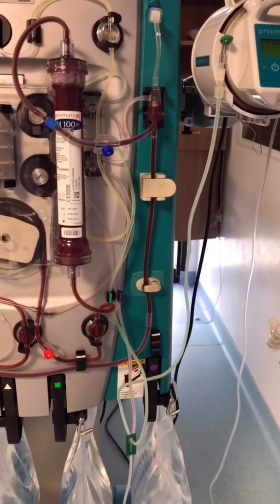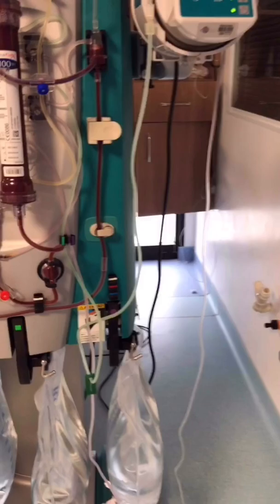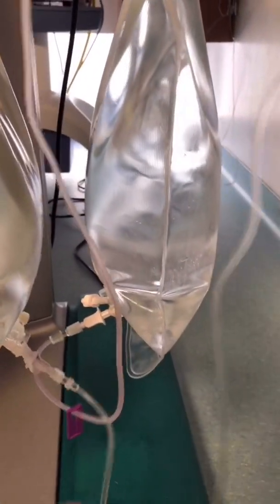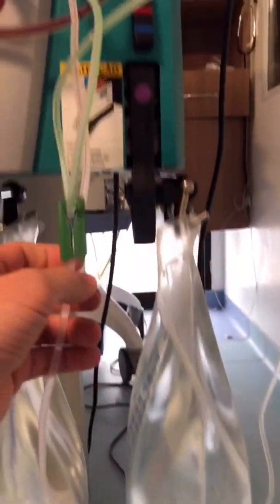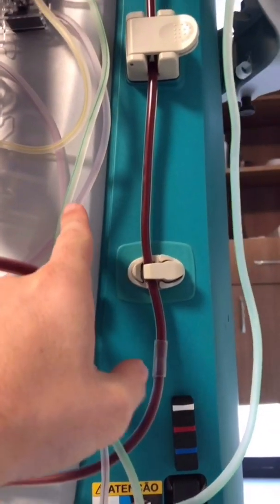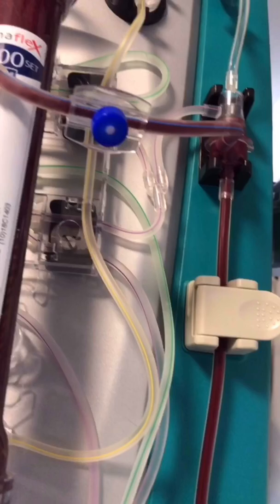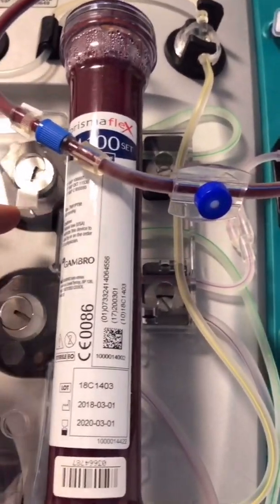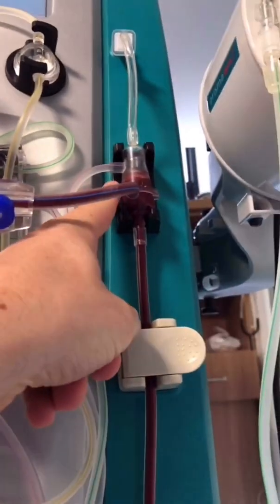The second circuit is the replacement solution line, which is the purple line. It comes from here, goes up along the purple track to the replacement solution pump, and then the solution goes up to here.